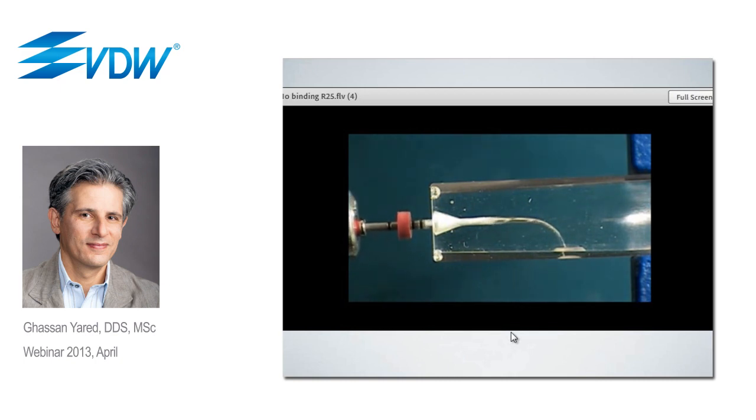And this is possible because, one, binding doesn't happen, and second, because torsional fatigue is theoretically eliminated. This is not how we use the reciproc instrument, but this is a video I wanted to show just to make you understand the efficiency of the concept and the issue of torsional fatigue and binding.